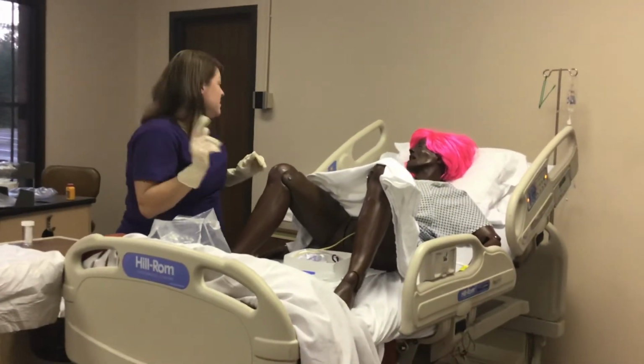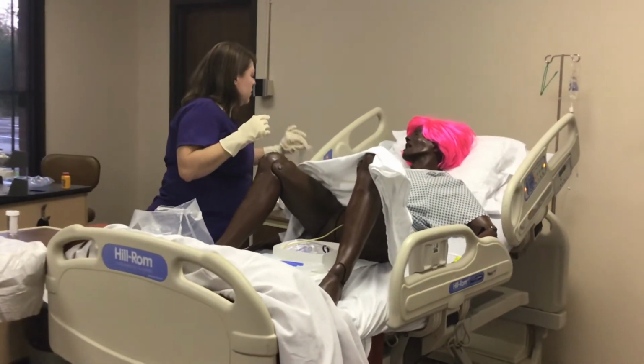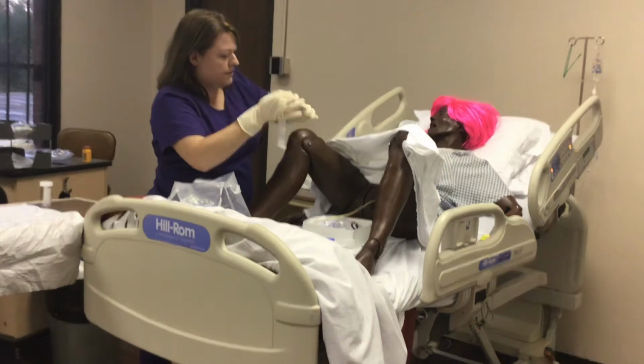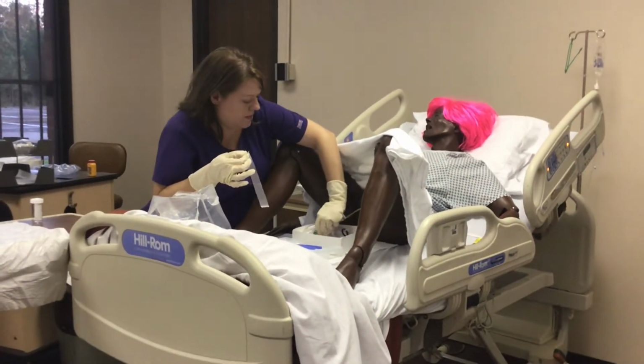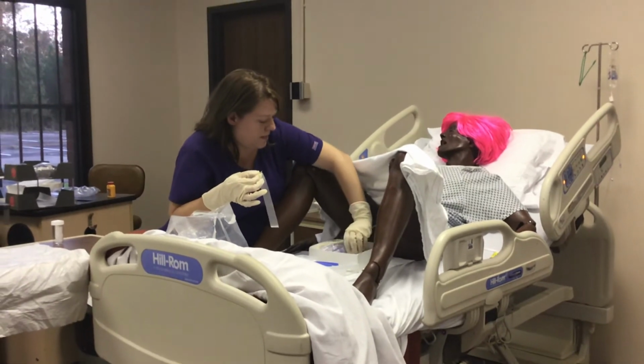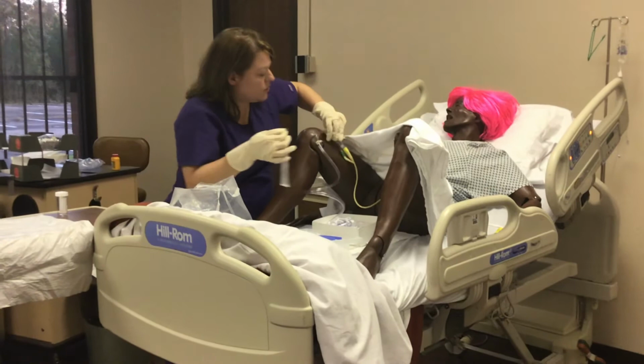But for time purposes, again, I'm going to skip that part. All right, so I'm going to take the catheter. I'm going to tape it to her leg.